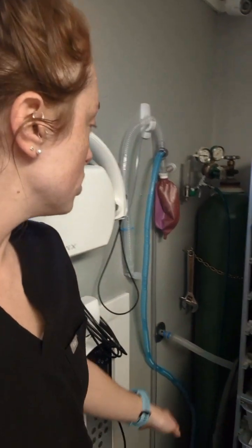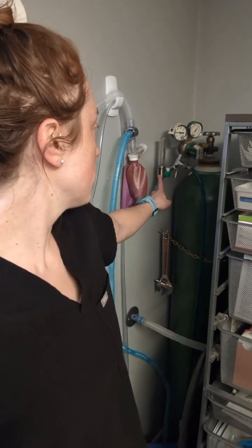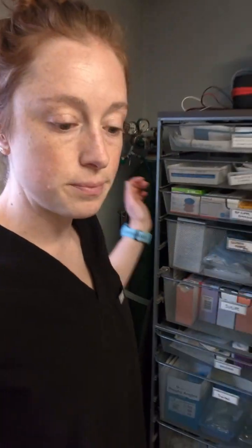For our compressed gas supply, we have oxygen in a size H tank. We also have a tank pressure gauge, a line flow meter, and a pressure reducing gauge here. That all attaches to this green tube, and that will connect with our rebreathing system to deliver oxygen to the system.